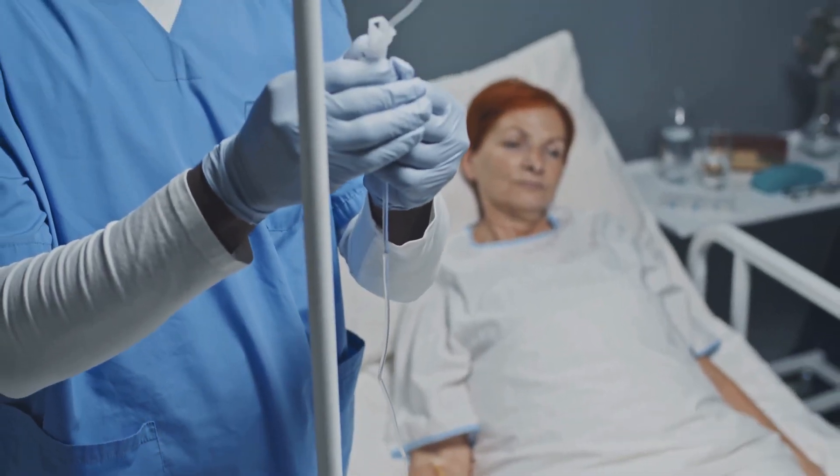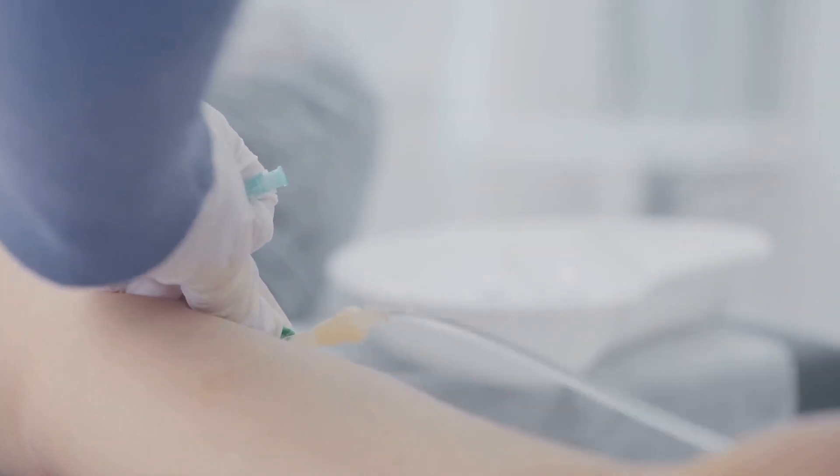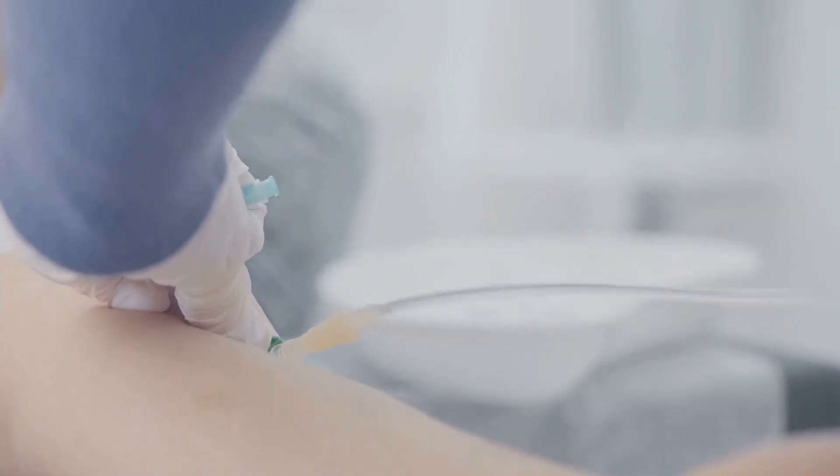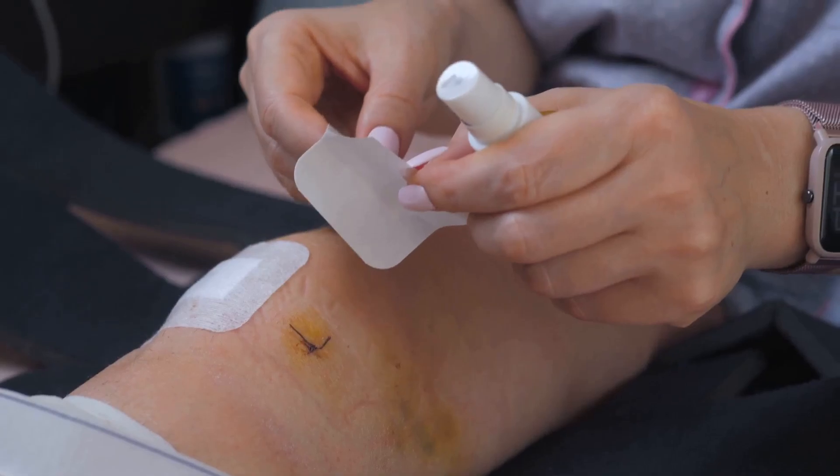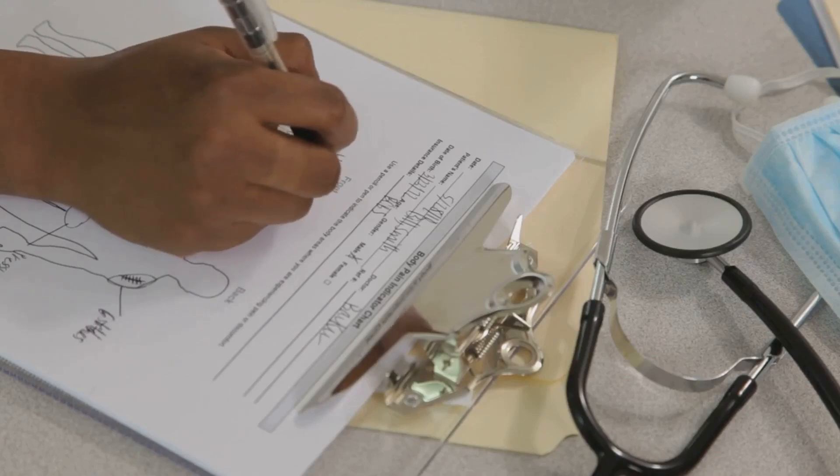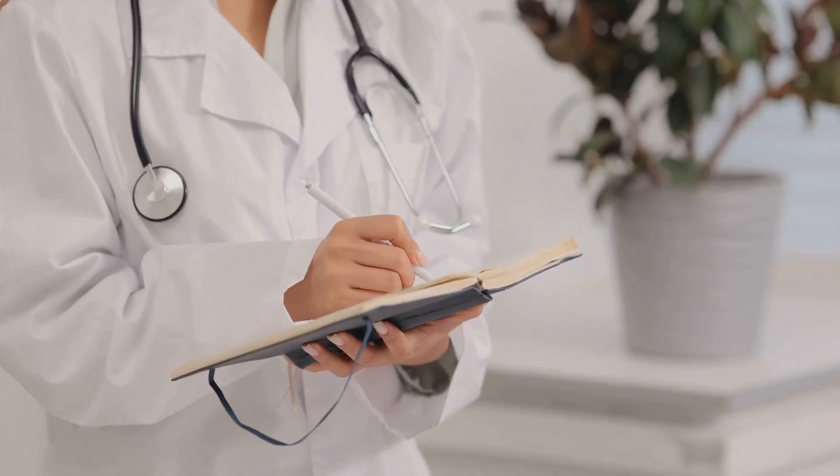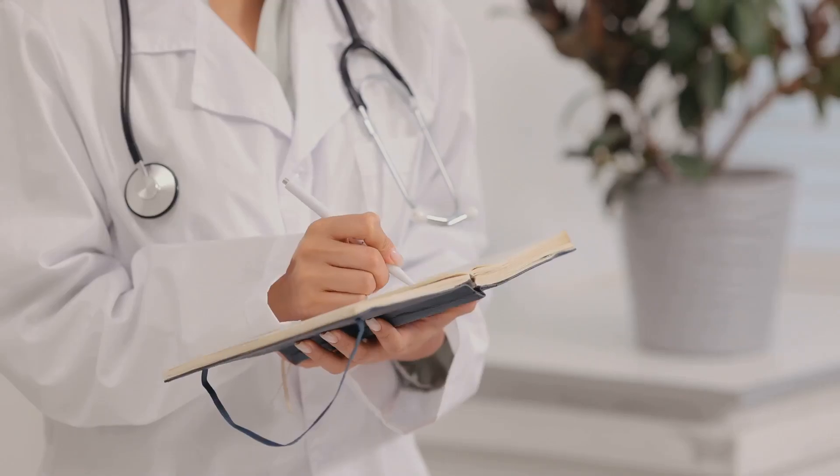Placing the cannula is just the first step. Monitoring and documenting every detail are crucial for ensuring patient safety and providing continuity of care. After cannulation, regularly check the site for any signs of redness, swelling, leakage or discomfort. Ensure the dressing is clean, dry and intact. Note the date and time of cannulation, the cannula gauge and site, and any fluids or medications administered. Any problems encountered and actions taken should also be clearly documented.